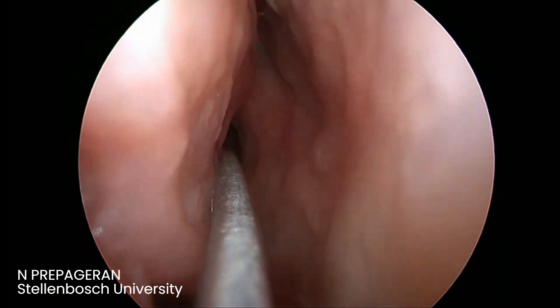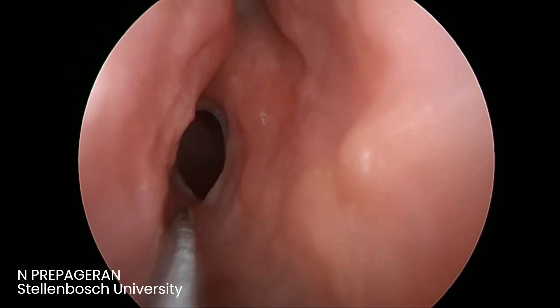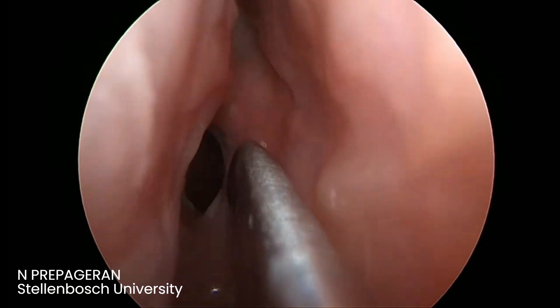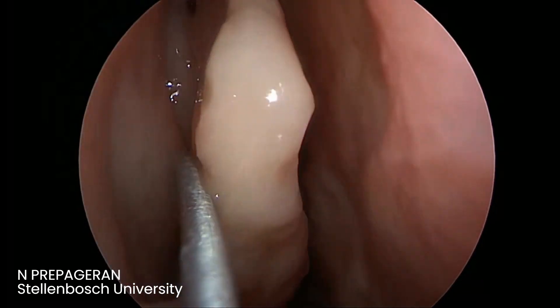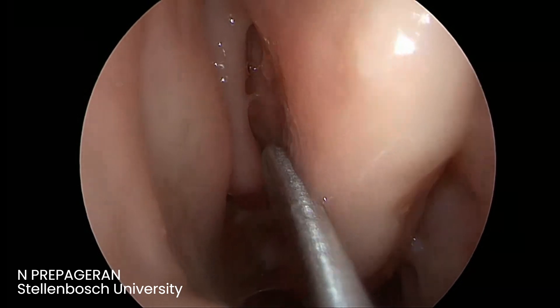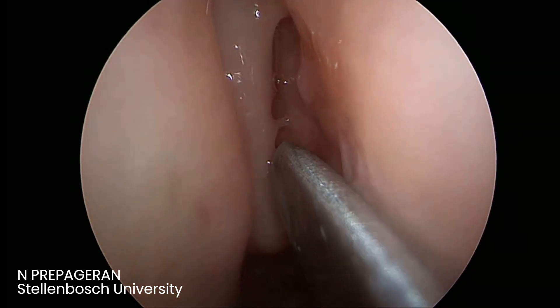And when you cut downwards, you just want to enlarge it downwards. Use a freer's elevator so that you don't damage the mucosal structures. Preserve the mucociliary currents; therefore the functional function will fall back to you. Now we go deep into the middle meatus itself. Here now, gate number one — you're entering it. Gate number three, the ground lamella.